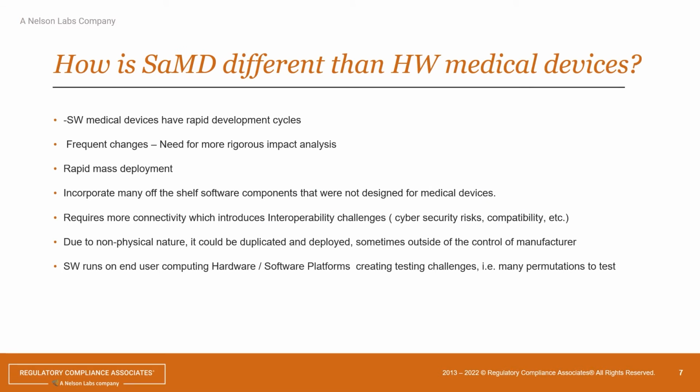And how is software as a medical device different from medical devices that may or may not have software in them? Usually software medical devices have a much quicker development cycle, especially if you're using Agile methodologies, and you're planning to release some portion of it that has enough functionality.